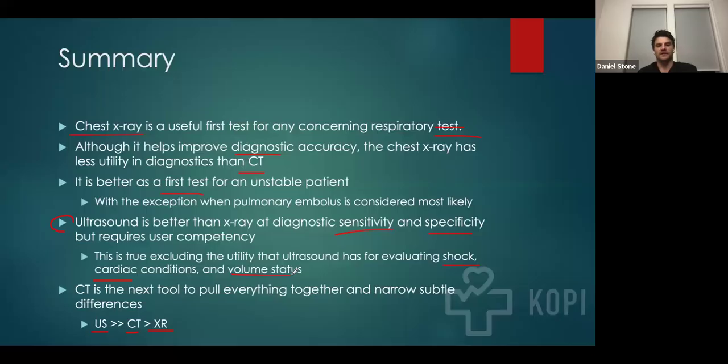But CT is the evolving tool. It's certainly become more widespread. I know that it's there at Celiani. It's becoming more available at certain Tanzanian hospitals like Meru. And it certainly does evaluate pathology a little bit better.